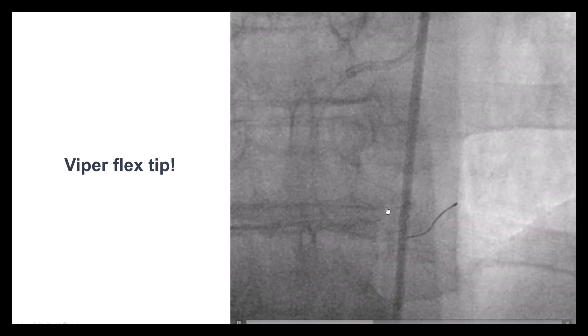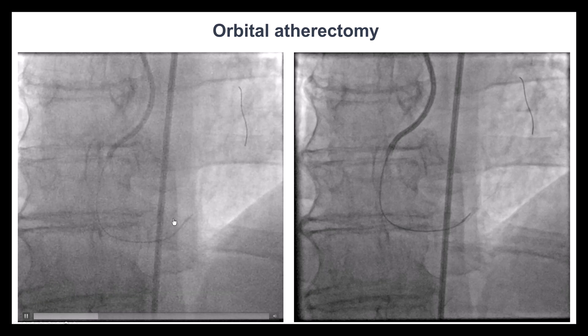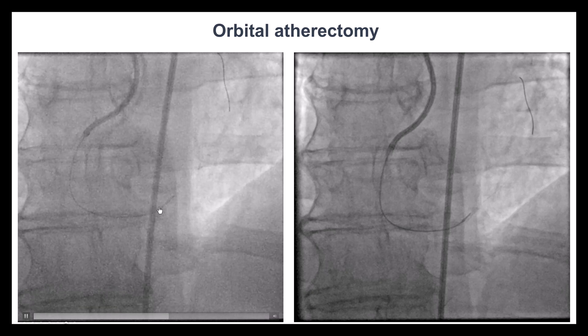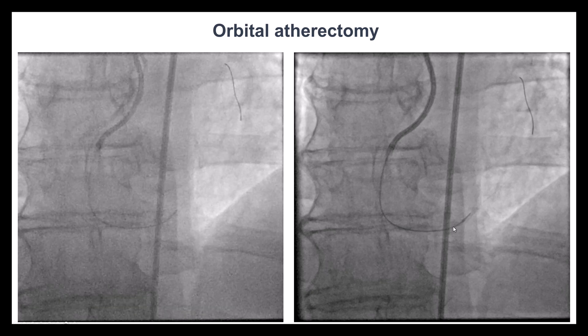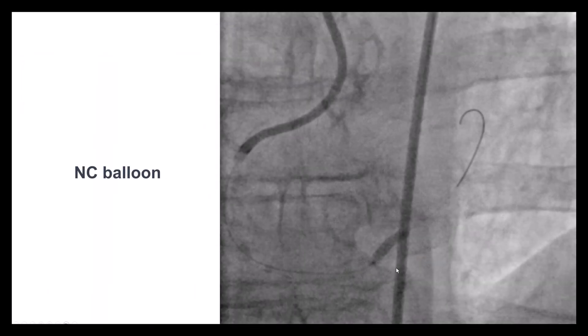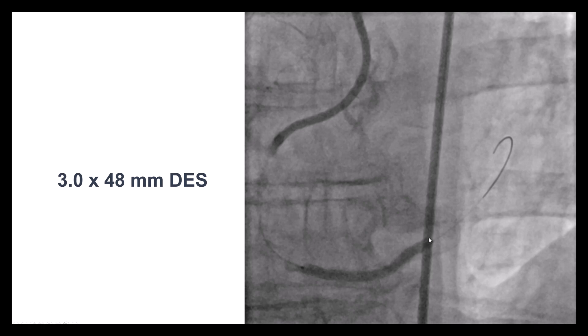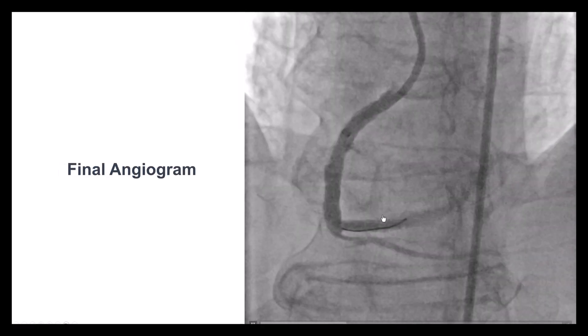These are the lesions where atherectomy is of primary importance. Both rotational and orbital atherectomy can be used. We performed orbital atherectomy using a new precision catheter, which is particularly important here so the catheter doesn't jump through the lesion and potentially enter a small vessel causing dissection or perforation. Eventually we were able to modify the lesion, then advance a balloon which expanded well. Intravascular ultrasound confirmed our suspicion that this was a calcified nodule. Finally, we placed a long 48-millimeter drug-eluting stent, successfully post-dilated with a nice final result.